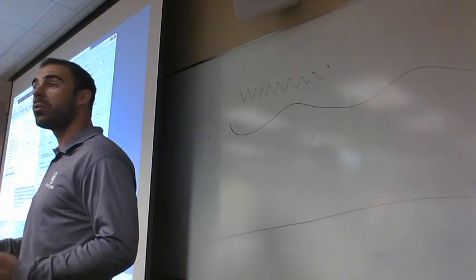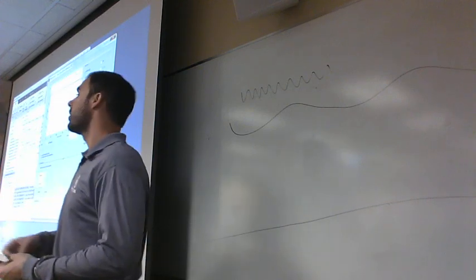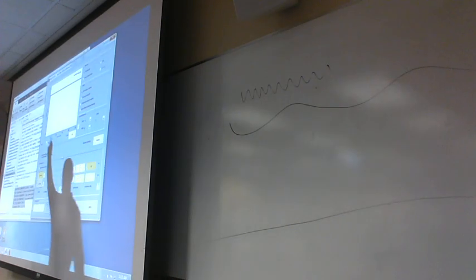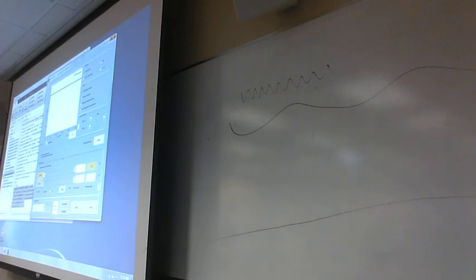Skin starts to sweat a little bit, you get a little warm, and the electrical potential starts to drift. What we want to do is filter those really low frequency drifts out. We want to clean that data up because this is a source of noise. It's an artifact, not like Indiana Jones artifacts, but an artifact like junk in the data.